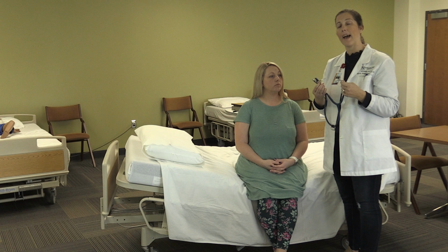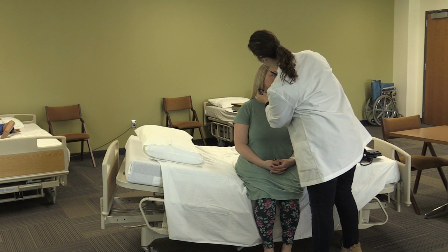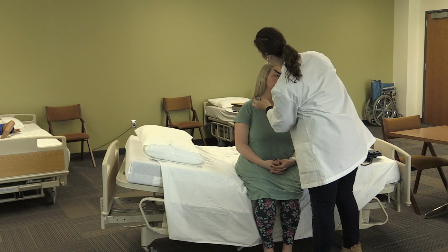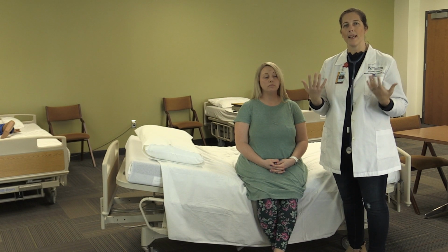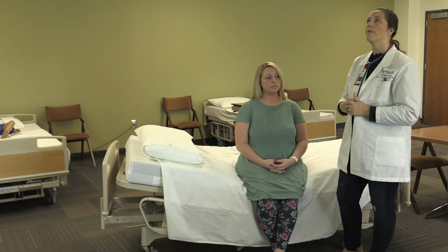So I'm going to go ahead now and listen to the opposite side. Can you hold your breath? So there are no bruits present, which would be the expected finding for auscultating the carotid bruits.